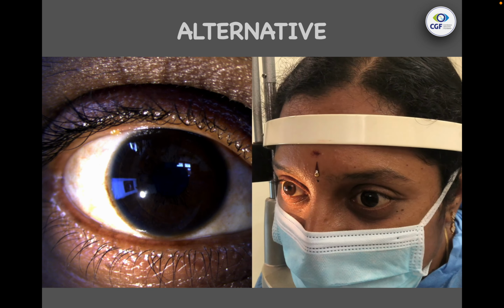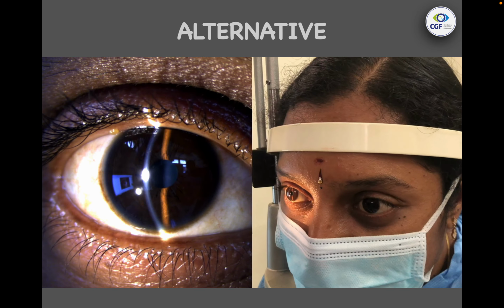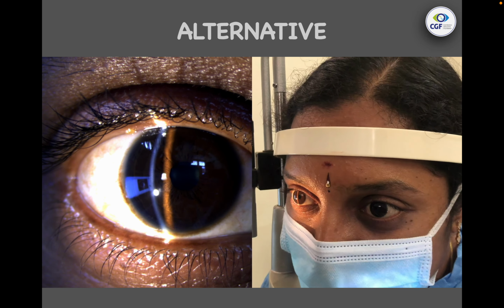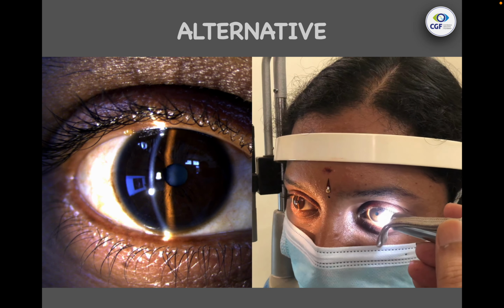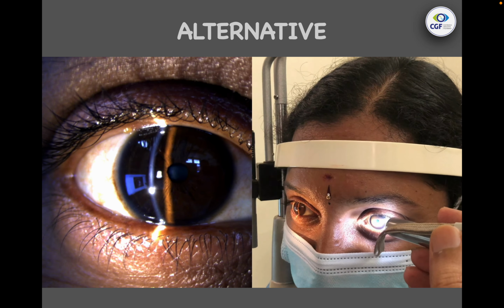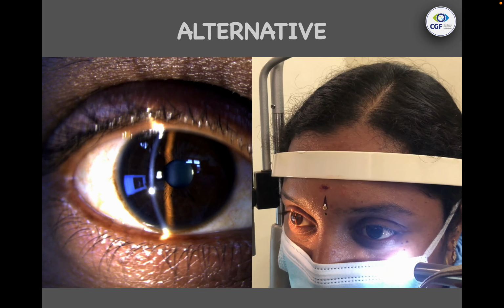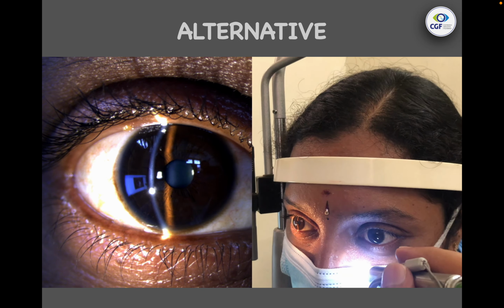See this video, the eye to be lasered is on the left. So when we show the light, the pupil constricts. Unfortunately, this is not sustained. When you show a light in the other eye, because of the consensual reflex, the pupil becomes very small.